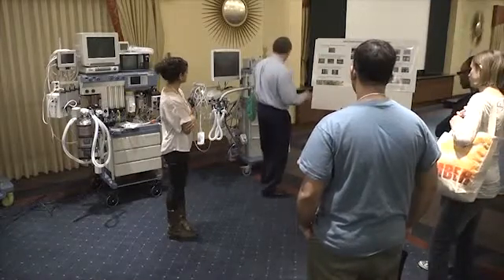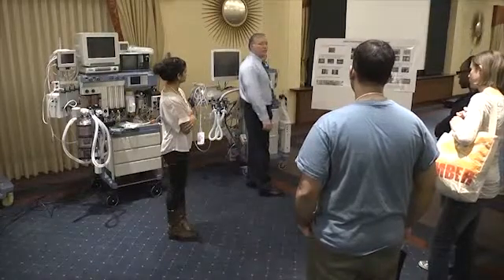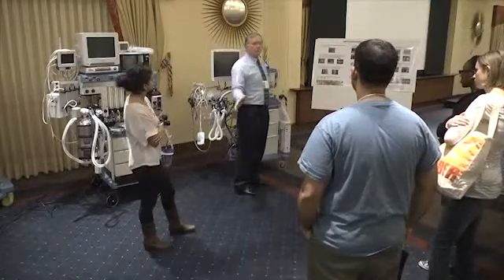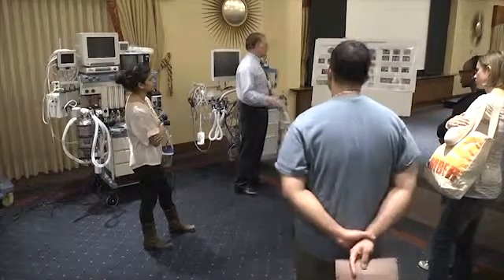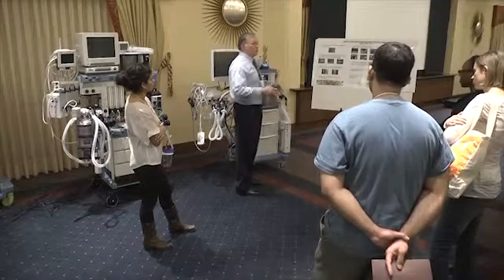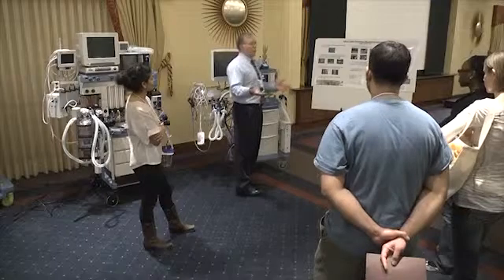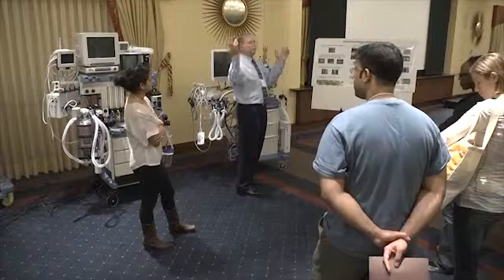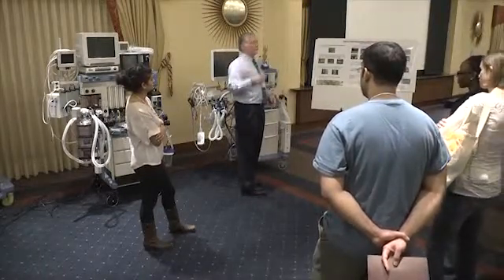Now, when people check their tank and pressurize it, and then close it, they look at the front and see that it looks like the tank is on, but actually your tank could be off. My suggestion would be to always keep your tank off while you're using your machine. Because if you were to lose your pipeline supply, there would be no alarms whatsoever. It would just start sucking out of the tank, and as soon as the tank went empty you would have an alarm, but by then you wouldn't have any backup. So it's better to know: oh, my system went out, walk around the back, open my tank, have half an hour and start screaming for more tanks.